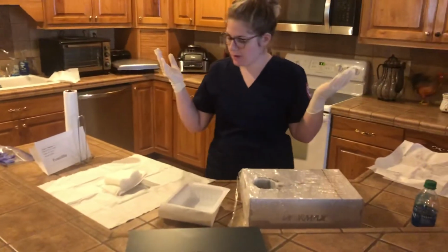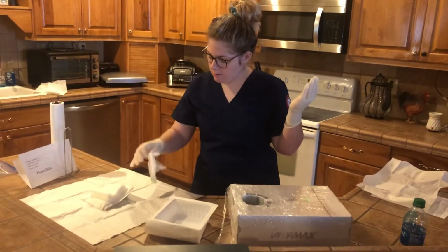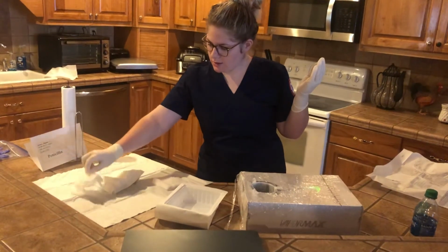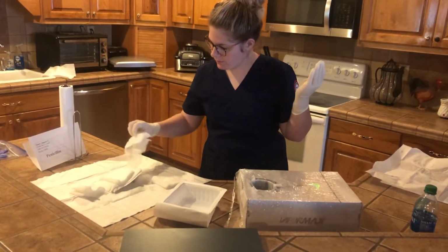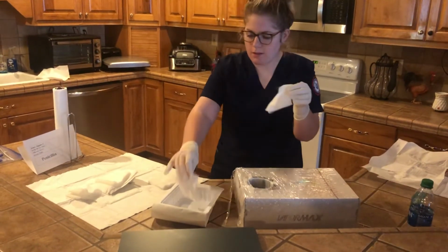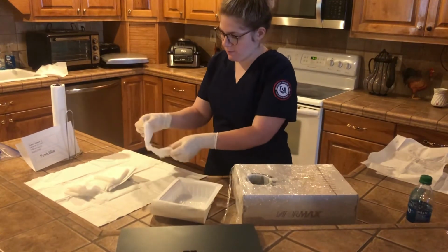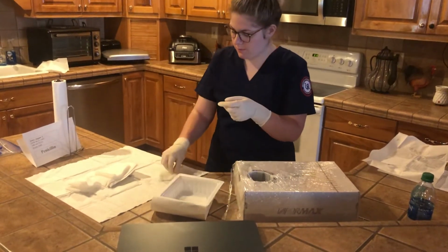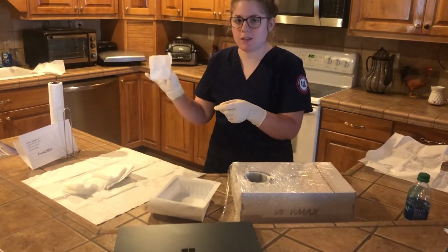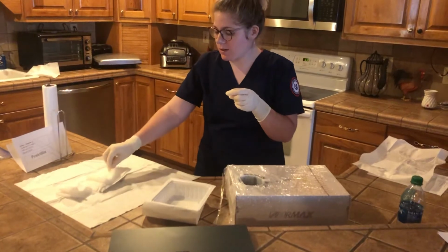I will first start with placing my gauze out, making sure not to put it around the unsterile border, and putting my gauze in the saline. This has touched an unsterile border, so I will throw it away and I will use another gauze.